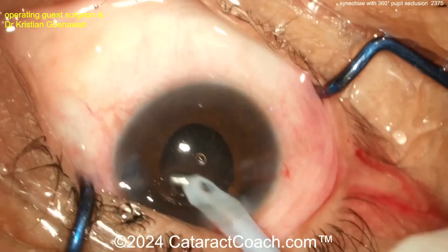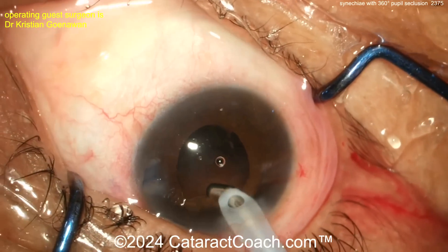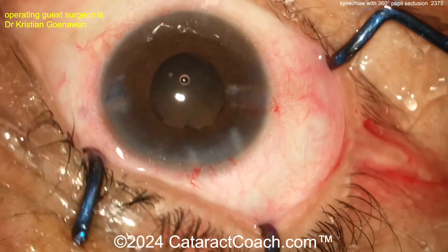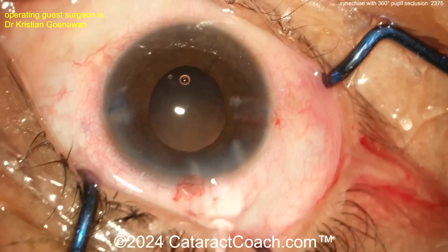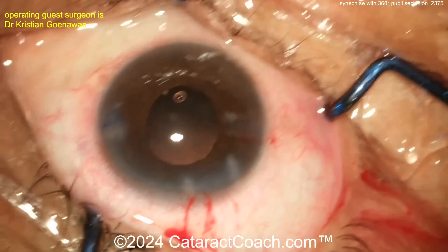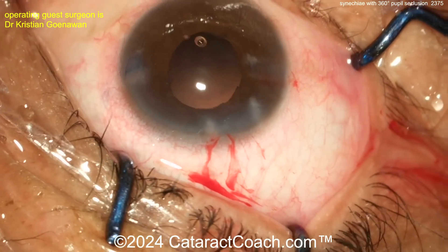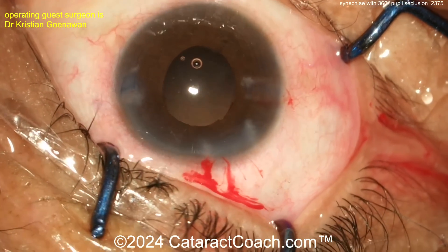The capsule looks pretty clean. Once you get the IOL in the capsular bag with the eye still full of viscoelastic, I like to use the chopper, Sinskey hook, or similar instrument to lift the iris 360 degrees to confirm the haptics and optic are all within the capsular bag, and to check for any retained cortex at the capsular bag equator. Fill the eye with viscoelastic. The lens choice will almost certainly be a monofocal. The IOL is being loaded by the assistant — you should definitely know how to load your own IOL in case your assistant is unavailable.